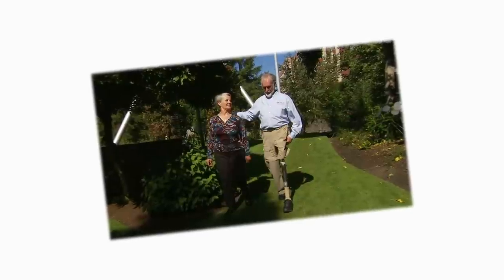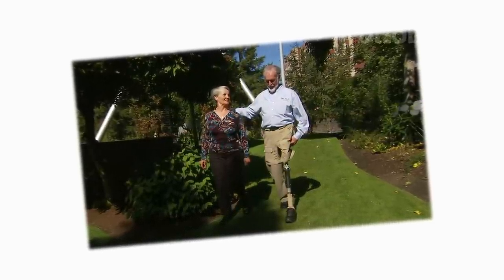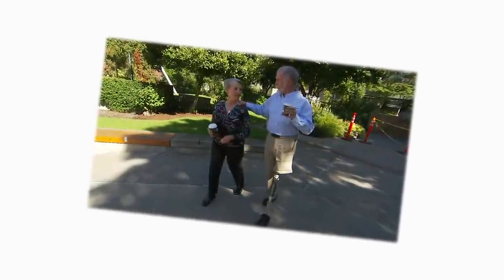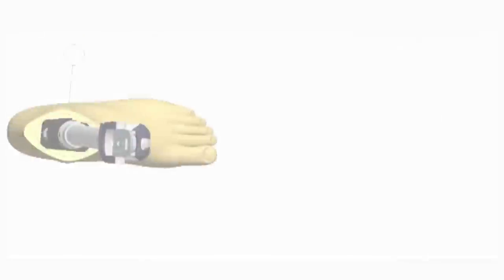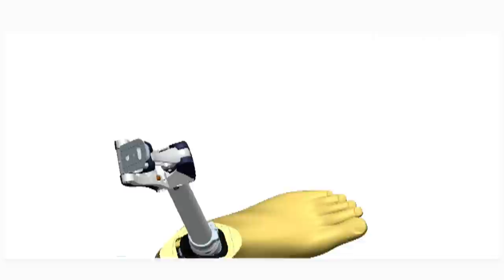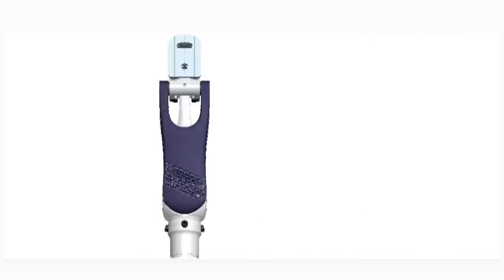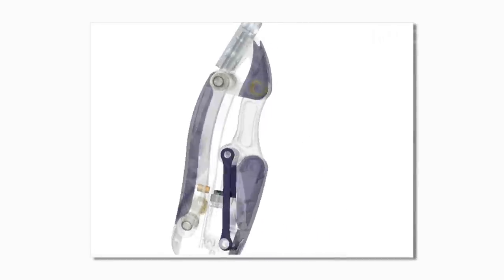The human pelvis rotates while you walk. This rotation helps you maintain balance and a natural walking pattern. Until now, no prosthetic hip joint provided this kind of movement. But the Helix actually flexes in a way that mimics the human pelvis. The unique polycentric design of the Helix hip rotates in and out, much like the human hip joint, as you are walking.